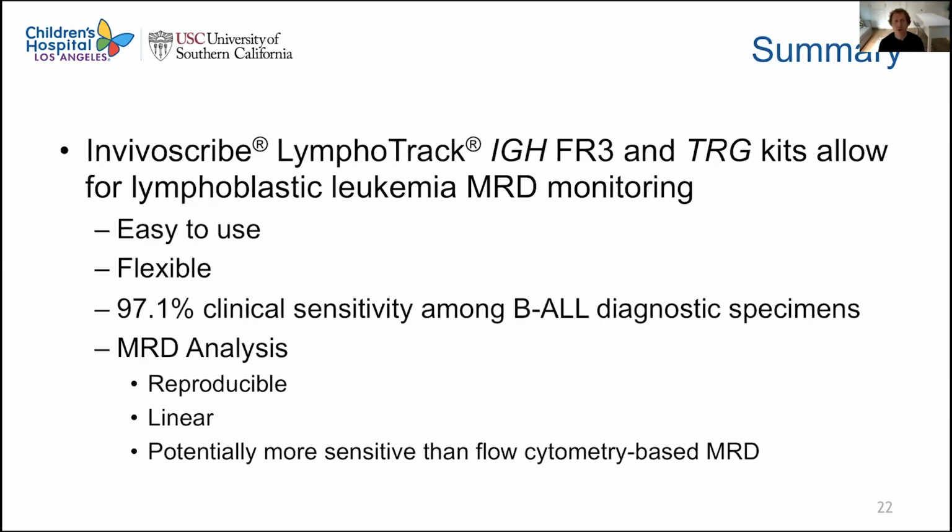So to summarize what I told you today, the Invivoscribe LymphoTrack IGH framework 3 and TRG kits allow for lymphoblastic leukemia MRD monitoring. We found them to be easy to use and flexible. We had a high clinical sensitivity for detecting clonal sequences in our B-ALL patient population, and our MRD analysis was reproducible, it was linear, and it was potentially more sensitive than flow cytometry based MRD.